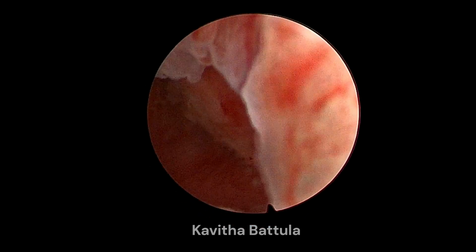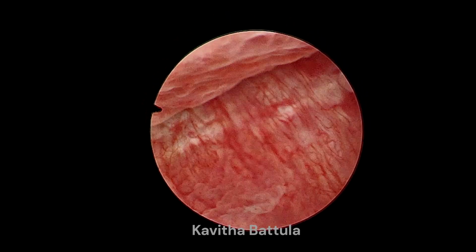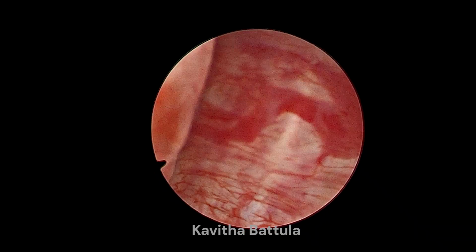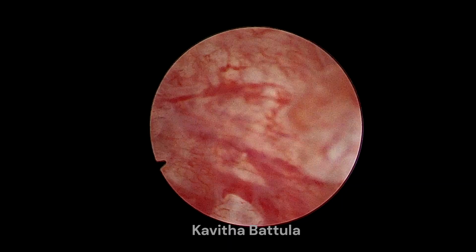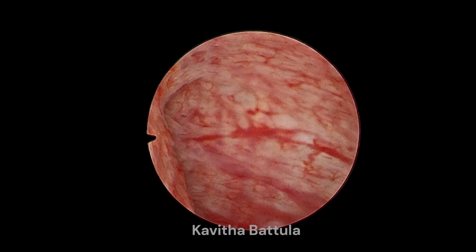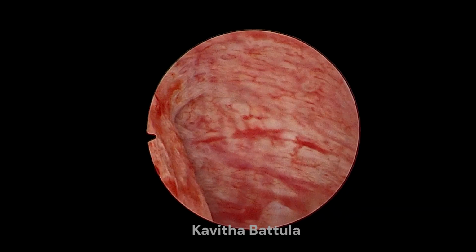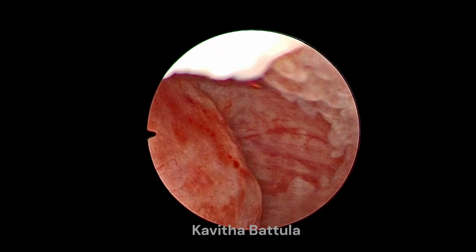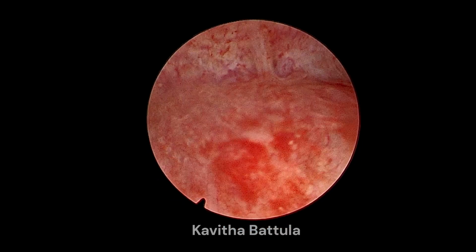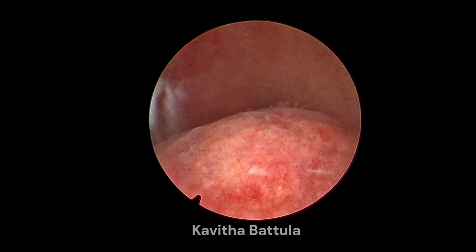On entering the uterus from the internal os, we see several fibroids, submucous. One was on the anterior wall towards the left side, around 3 by 2 centimeters. It is kind of a type 0 fibroid. Another fibroid is on the posterior wall and towards the right side. It is around 2 centimeters.